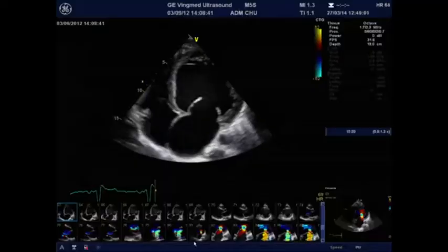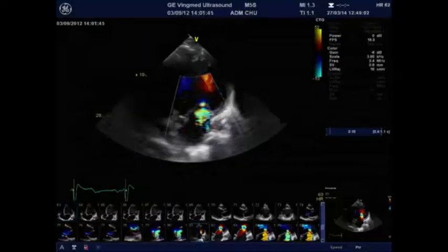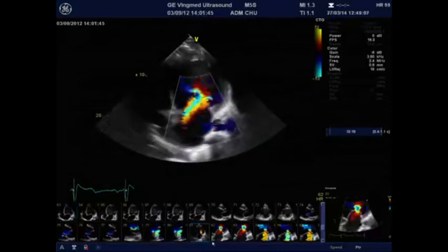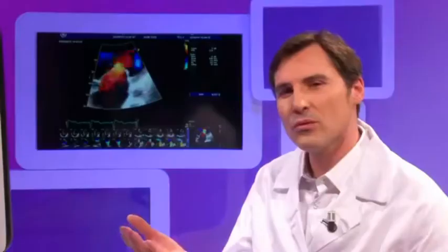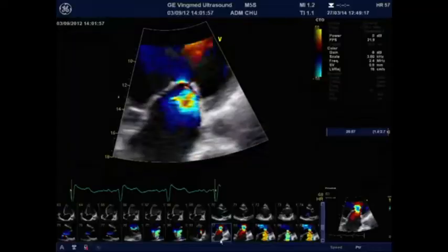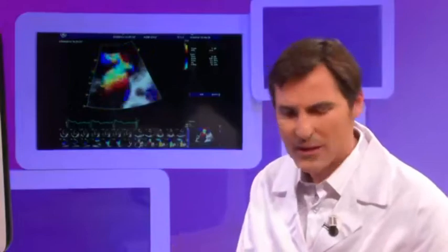So with the apical view, we need again the color. And here you have the regurgitation. With the regurgitation that you can get, for sure, you need to zoom. And why you need to do this? Just to maximize the frame rate, of course. So in these patients, always use a small box, as narrow as possible, and also the imaging depth should be reduced as narrow as possible.